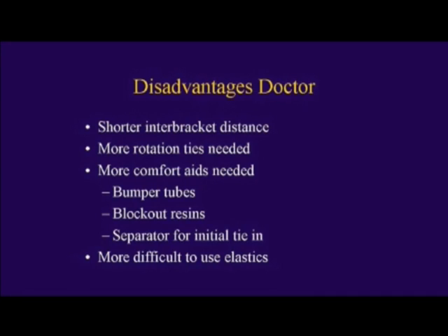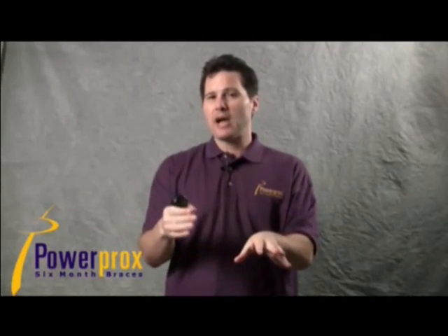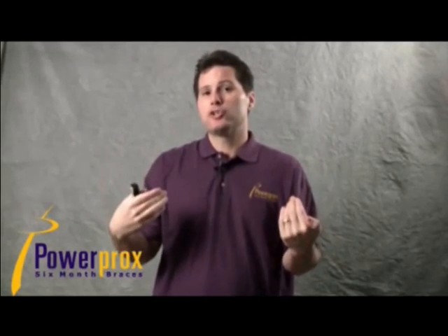I like to have my patients on that first month, I like to use those extra comfort aids. We use bumper tubes on areas of exposed wire, and I like to do my initial tie-in on the posterior teeth with separators as opposed to O-ring elastic. The separators are bigger and more cushioned, and it allows for a very comfortable start to treatment.